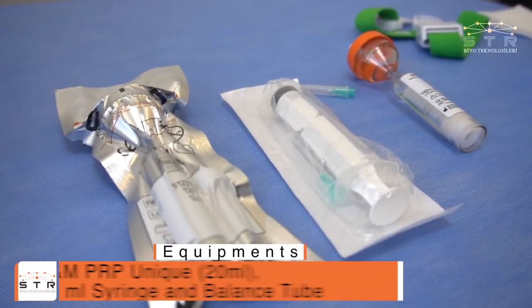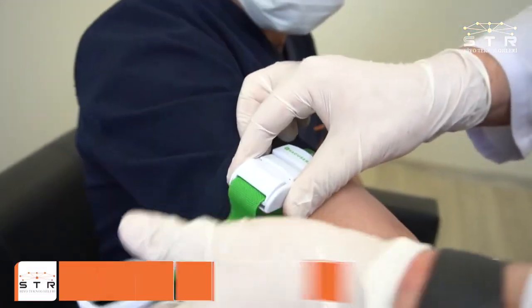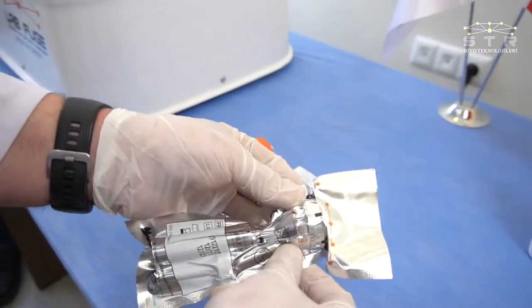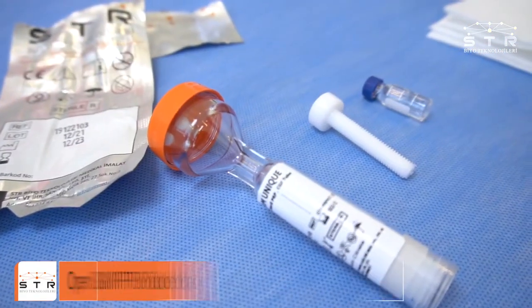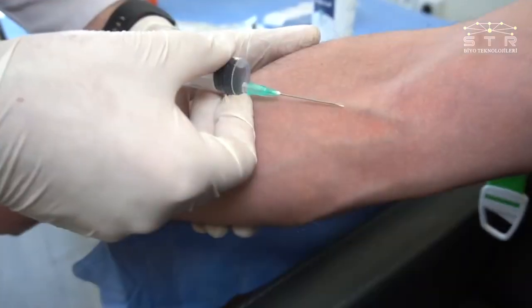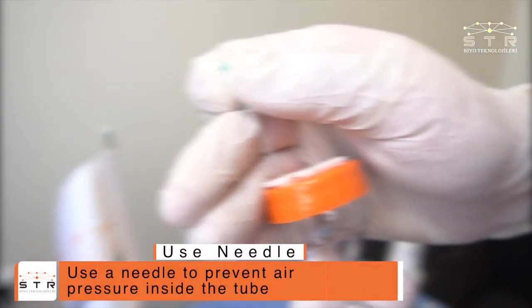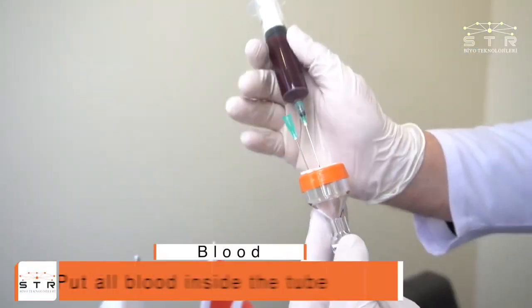S&M PRP unique 20 milliliters syringe and balance tube. Blood sampling taken until the 18 milliliters line. Take sodium citrate 1.5 milliliters into the syringe. Use a needle to prevent air pressure inside the tube and put all blood inside the tube.